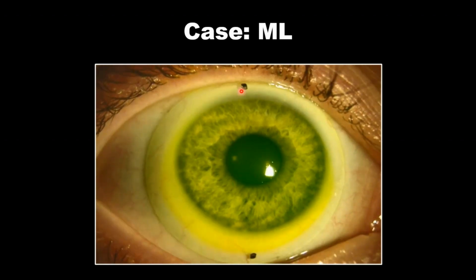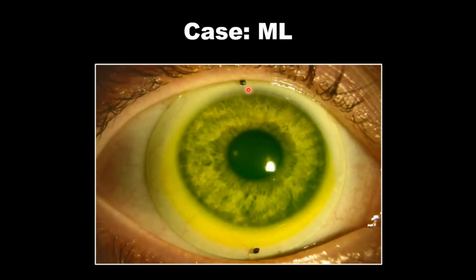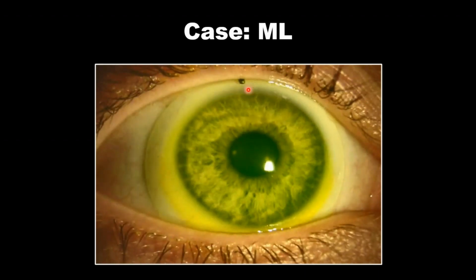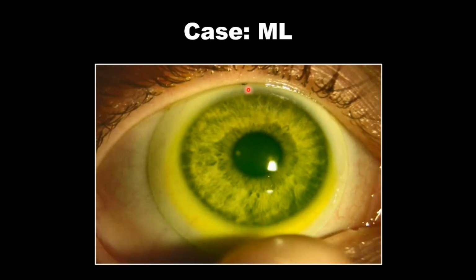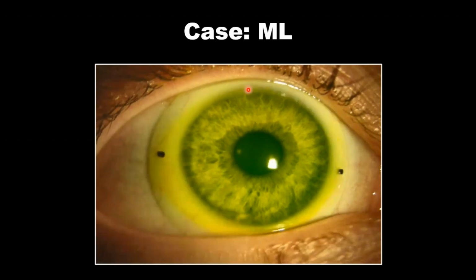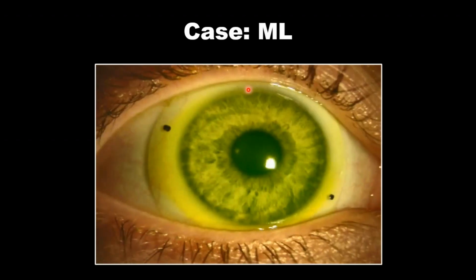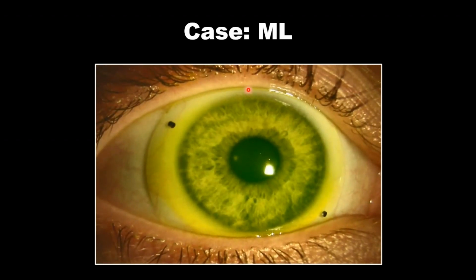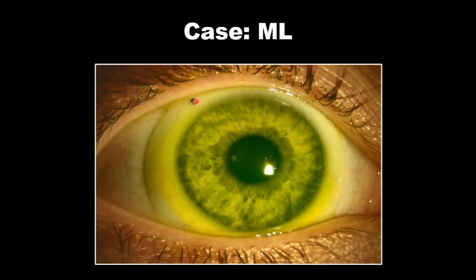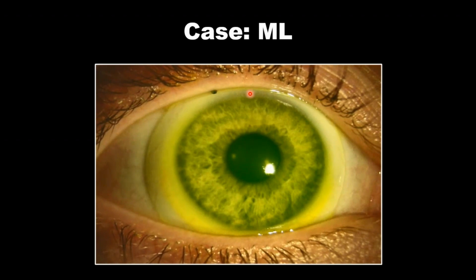So the axis of these scribe marks is what you're looking for, not whether they're 20 degrees clockwise, 20 degrees counterclockwise. You want to tell the lab what axis those markers position at. And then when you have your residual astigmatism added, it has its own axis that's independent of the flat meridian markers, these scribe marks, where the flat meridian of the sclera is.